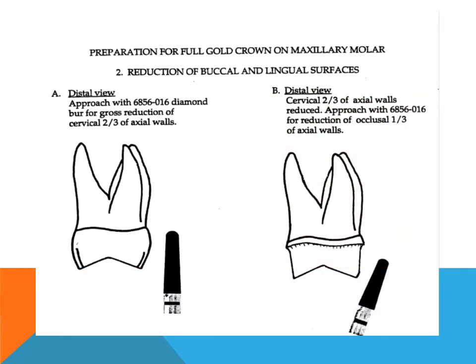Reduction of buccal and lingual surfaces: The axial surfaces are reduced just enough to remove all axial undercuts, establish a 5-degree taper to occlusal, and create a chamfer finish line approximately 0.5 mm above the crest of the gingiva. The gross reduction of the buccal and lingual surfaces is started with a round-ended tapered diamond burr, held parallel to the long axis of the tooth. The rounded end of the burr will create the chamfer margin, and the taper of the diamond burr establishes the necessary convergence to the occlusal.